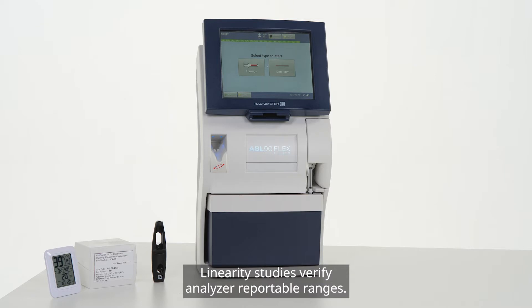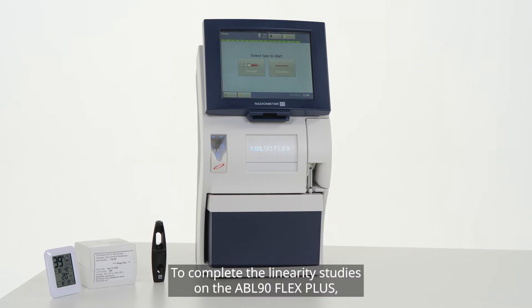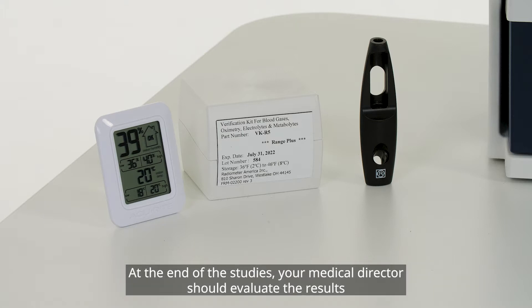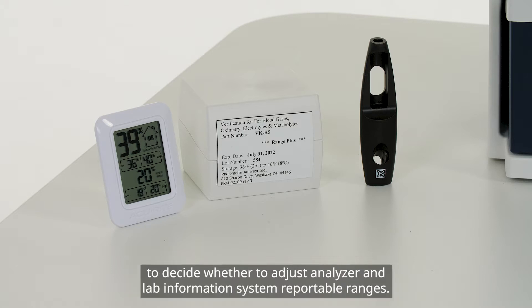Linearity studies verify analyzer reportable ranges. To complete the linearity studies on the ABL-90 Flex Plus, external ampoules of ACCUIS solution with known ranges are used to test the upper and lower limits of each reported parameter. At the end of the studies, your medical director should evaluate the results to decide whether to adjust analyzer and lab information system reportable ranges.